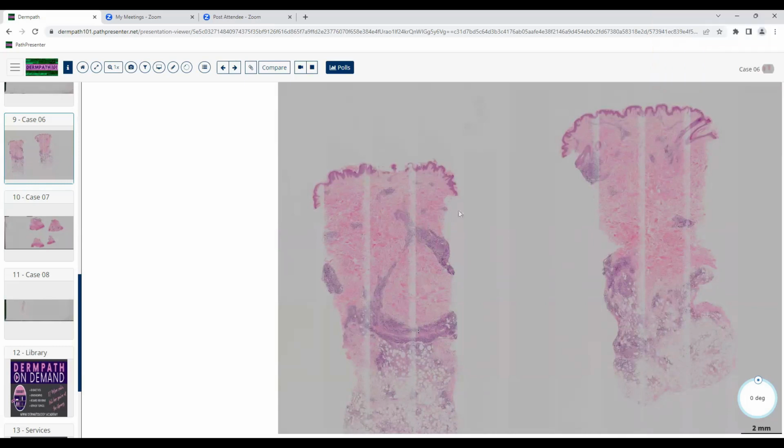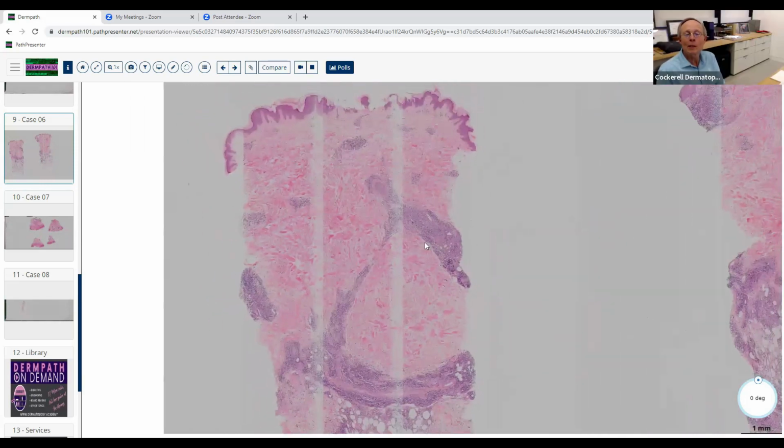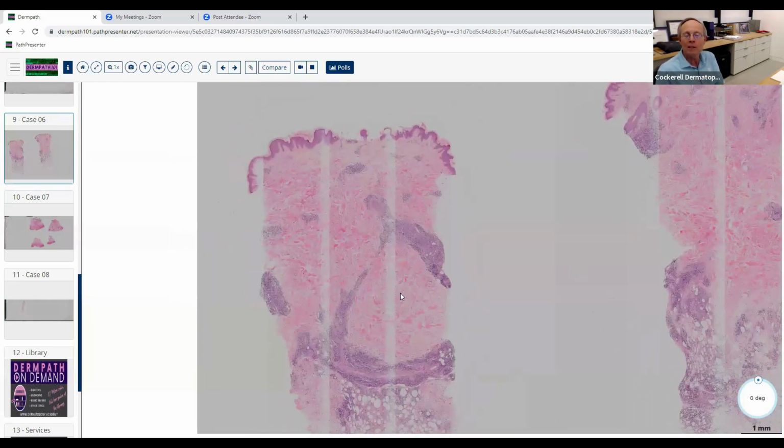Okay, well, we've got to get you guys up to speed on that. I know that some of your senior residents have heard that. Somebody want to help her out? What are the L's that give you lymphocytic infiltrates in the skin primarily? You guys know this, come on.